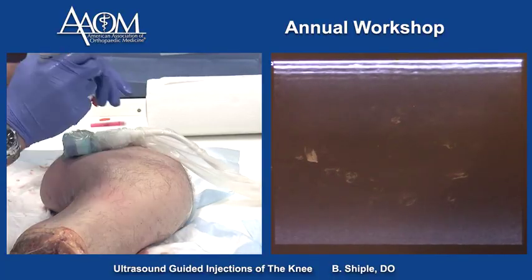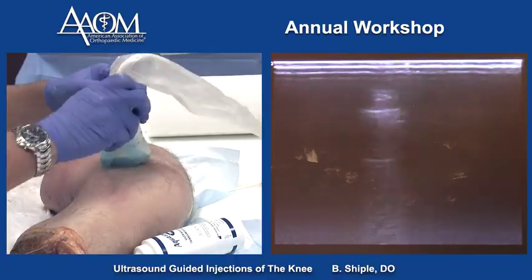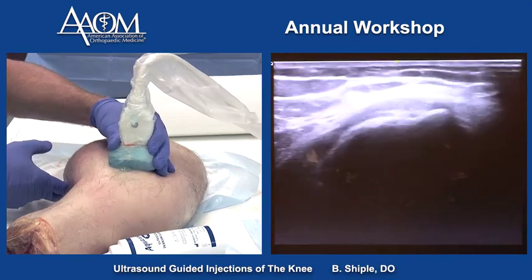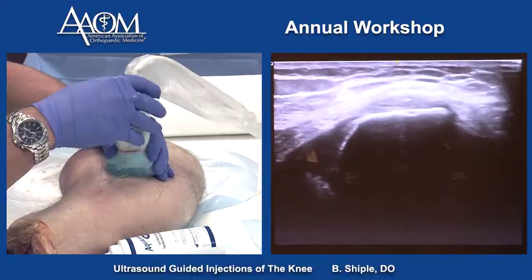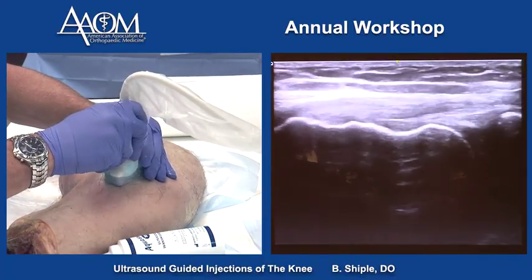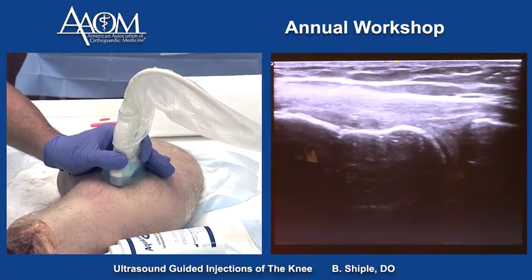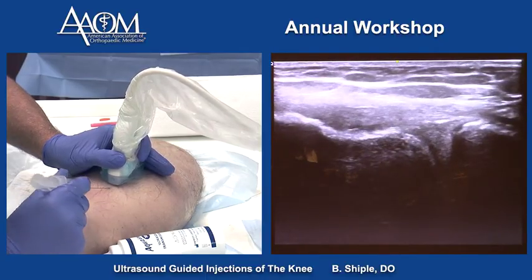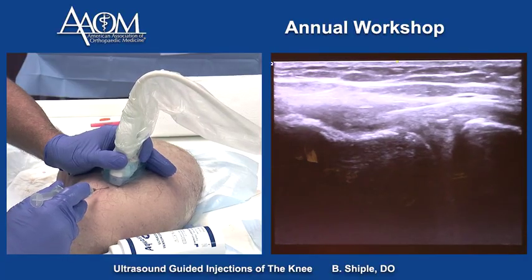To find the adductor tubercle where the MCL originates, we use the short axis slide from the VMO down — you'll see the femur rise up, and that's the adductor tubercle. Once we're in the body of the MCL, we pivot the probe 90 degrees so we have the MCL lined up perfectly, and we can inject the MCL in long axis. That's the needle placement into the MCL.